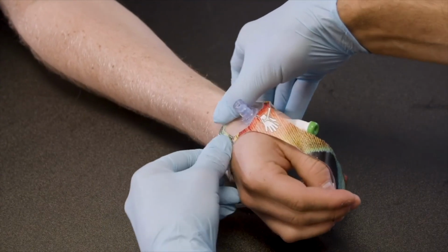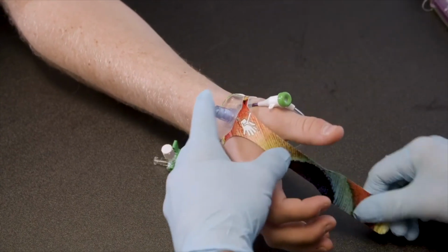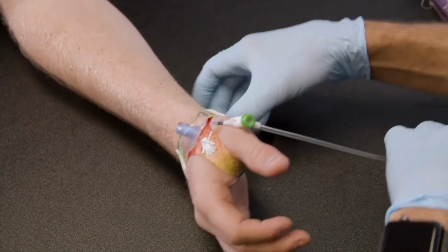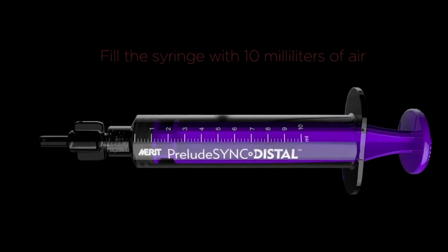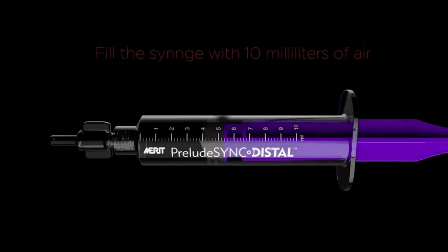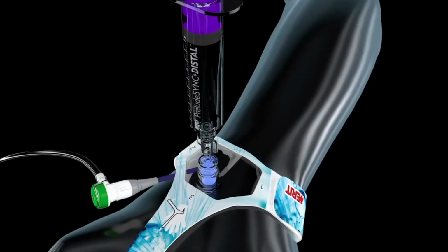Fasten band 1 and 2 tightly around the wrist, then place band 3 around the saddle of the thumb without any slack. If the sheath is in the way of securing band number 3, then band number 3 may be secured after removal of the sheath. Fill the included syringe with 10 mLs of air. Maximum balloon fill volume is 10 mLs. Engage the syringe into the valve on the top of the device.